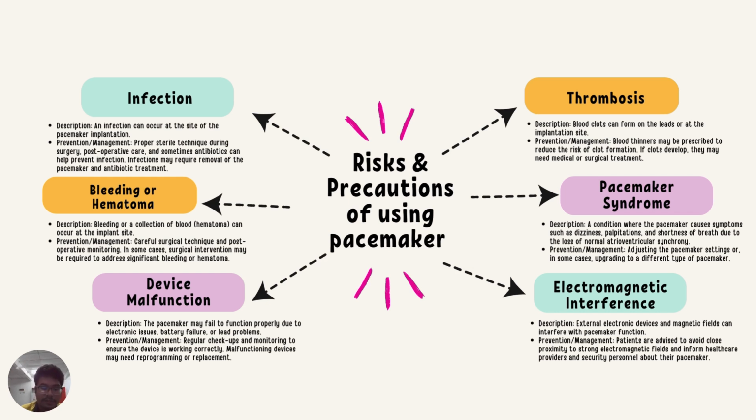Okay, the third one will be device malfunction. Description: the pacemaker may fail to function properly due to electronic issues, battery failure, or lead problems. So, the precautions that we can take are regular checkups and monitoring to ensure the device is working correctly. Malfunctioning devices may need reprogramming or replacement.